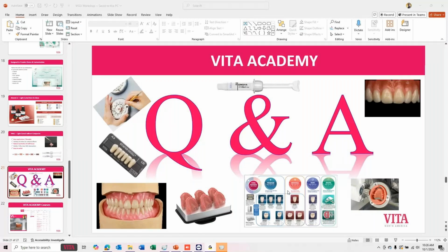How much longer do the milled composite teeth last compared to the milled PMMA? Like I said, the milled and printed PMMAs are wearing out in 1 to 2 years, at least that I've seen so far. The composite teeth last as long as the denture teeth do. It's almost exactly the same material. And most of the paperwork that I've seen on it so far is very, very comparable to the carded denture teeth. I probably have a chart and some papers on it, so if you guys want that, I'm happy to send it to you.